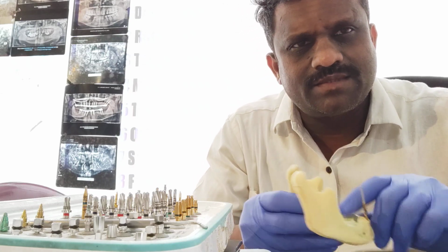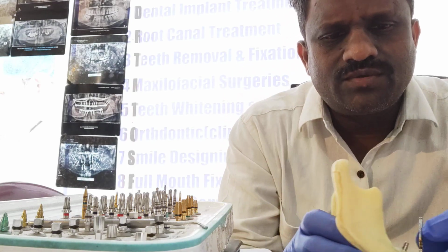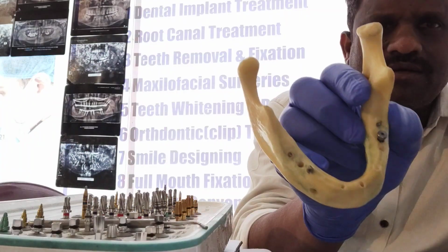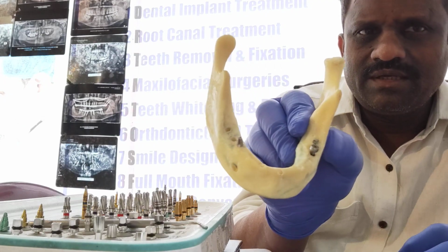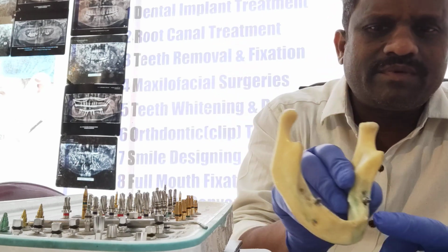Good morning. Hands-on osteotomy. There is a placement of the implants in the mandible. So here the osteotomy has been done. Osteotomy has been done in 5 to 6 places. Here on one I have placed the conventional implant. Upon that I have placed the healing cap. So I have placed the healing cap on this one.